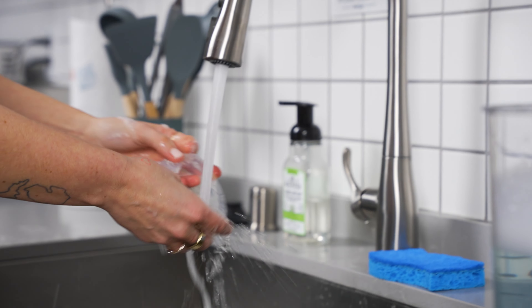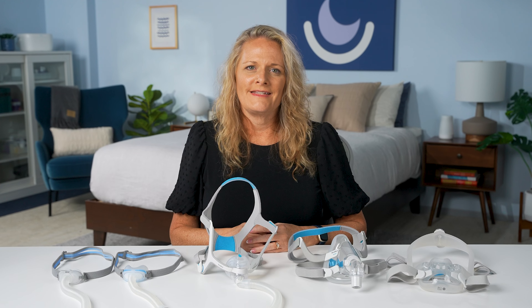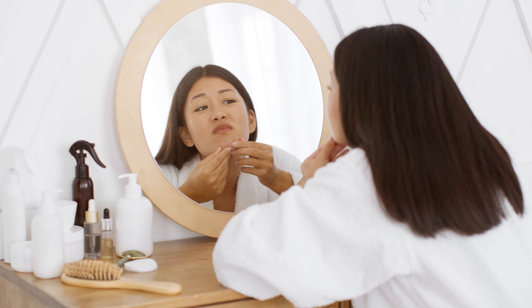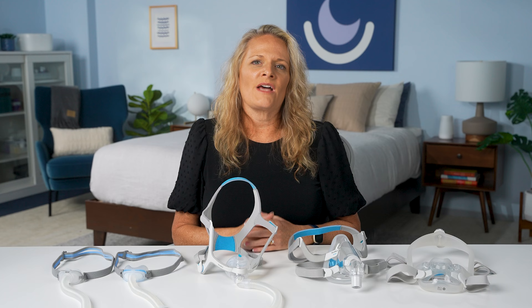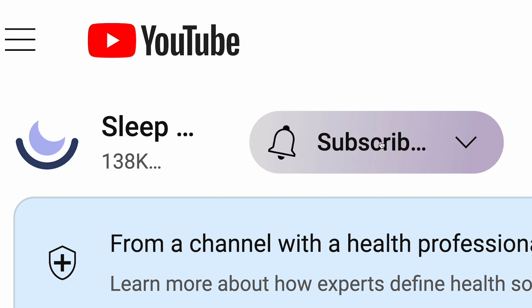Let's talk about maintenance and care of your CPAP masks. You should be replacing your mask at least every three months. You should clean your mask weekly with warm soapy water and wipe down your cushions daily using a CPAP wipe, or pop them out of the frame and use warm soapy water. If you don't properly clean your mask, it can lead to respiratory infections, problems with acne or skin irritation, and can promote an increase in mask leakage.